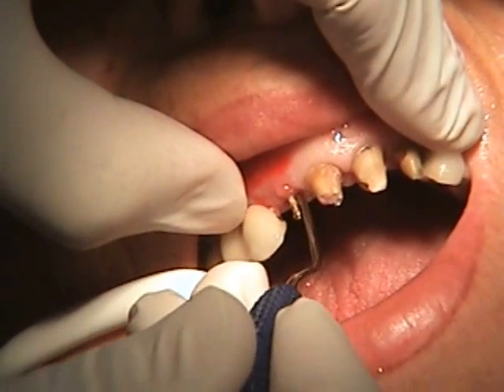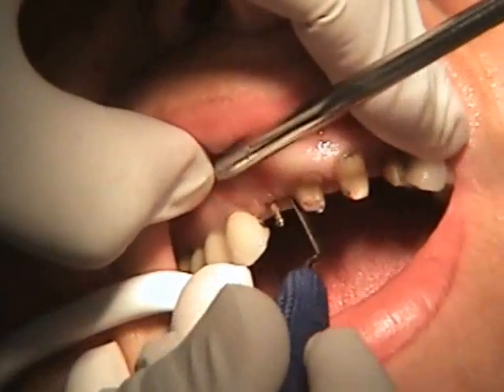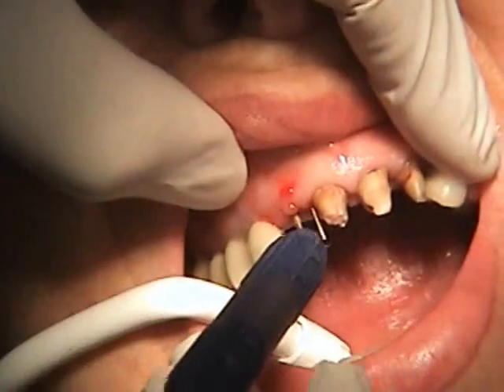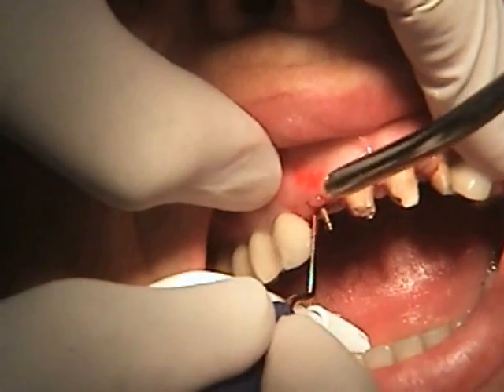First, we're going to utilize a periotome to break the periodontal ligament connection. Here it's going in on the proximal aspect. We're going to rotate it and use pressure to drive it into place — it's on the mesial. Then we'll repeat that on the distal.